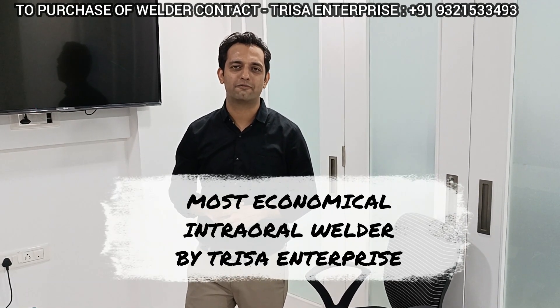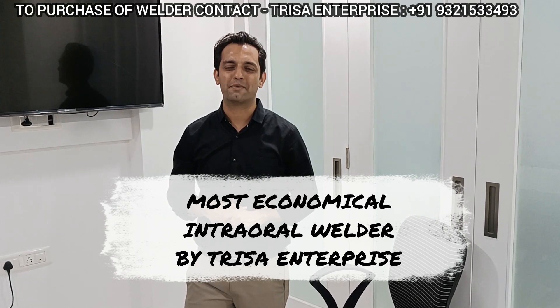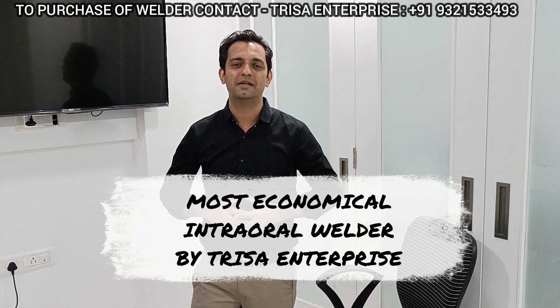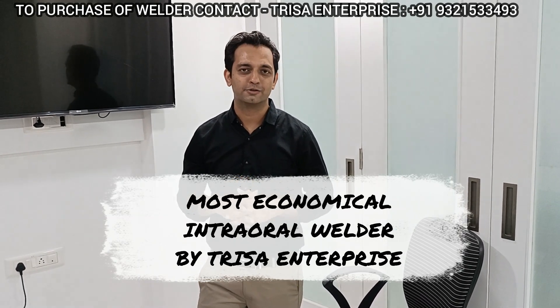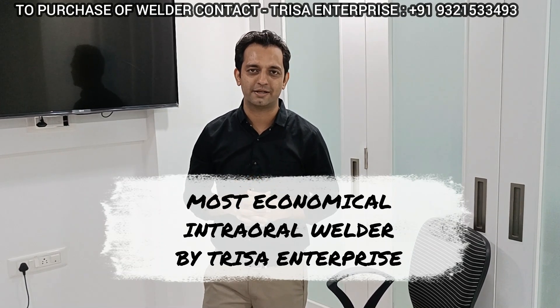Dr. Rohan Virani here, your mentor for Masonic Plants. Today I'm going to introduce to you an amazing machine — the Trisa Enterprise Welder. It's an amazing machine with amazing features and, more importantly, amazing pricing. So without wasting any further time, let me show you this most economical welder by Trisa Enterprise.